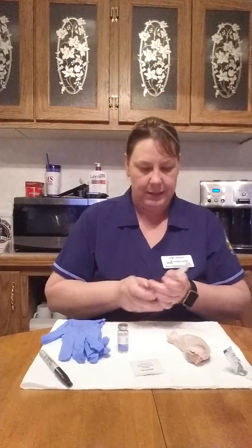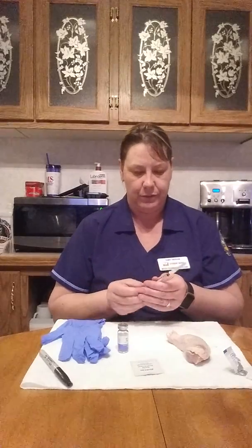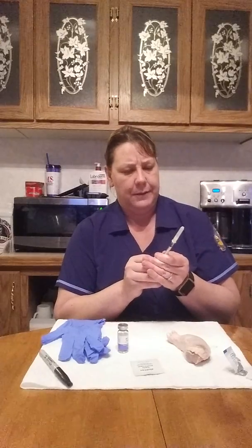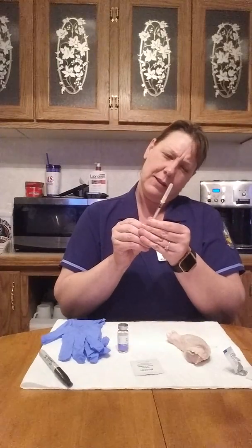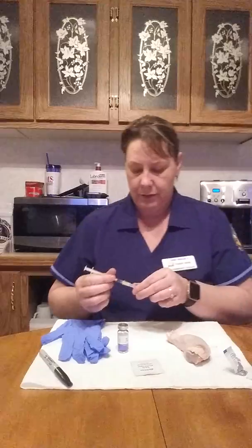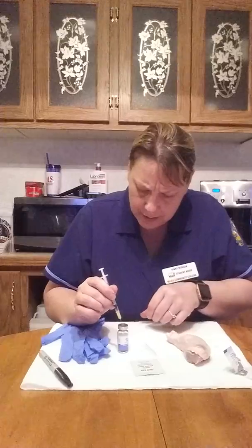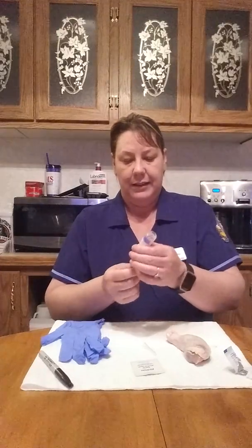Go ahead and get my syringe ready, and I'm using a 1 cc or 1 milliliter syringe, and for tuberculin I'm going to administer 0.1 milliliters. So I'm going to go ahead and set my plunger at 0.1. Go ahead and take the top off of the needle, and I'm going to place it down into the vial, and I'm going to put in the same amount of air that I'm going to take out.